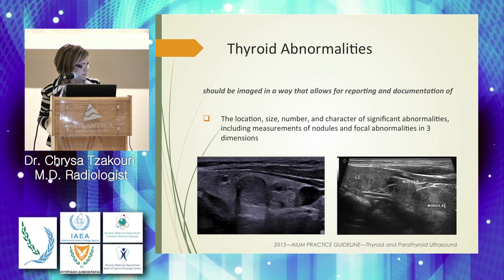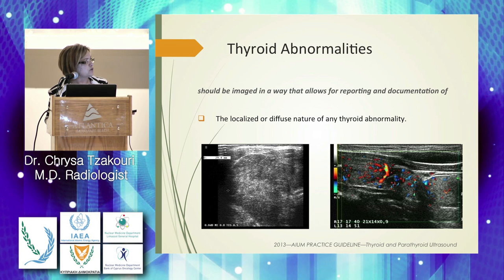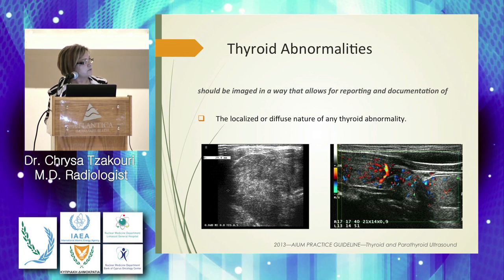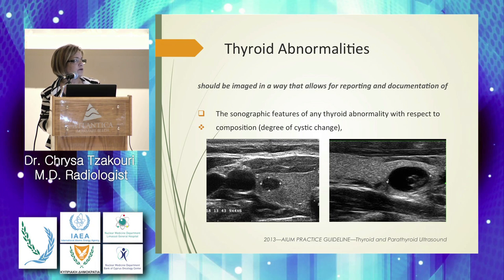For example, when multiple nodules are present in longitudinal views, each must be measured and outlined for documentation. A transverse grayscale ultrasonography may show diffuse thyroid enlargement and irregularity, complemented by power Doppler imaging. A marked hypoechoic solid lesion surrounded by normal thyroid tissue may be seen, and one must differentiate whether there is posterior acoustic enhancement suggesting a cyst versus a solid lesion with a solid peripheral component.